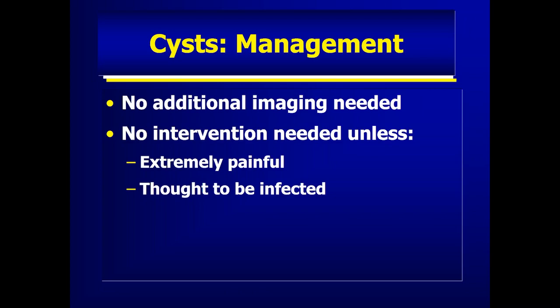So when we find cysts, really no additional imaging is needed. No additional intervention is needed unless it's extremely painful and the patient desires aspiration, or perhaps it's thought to be infected, and then we're going to send the material to the laboratory.